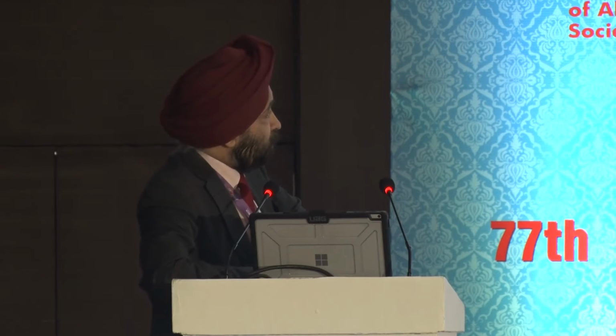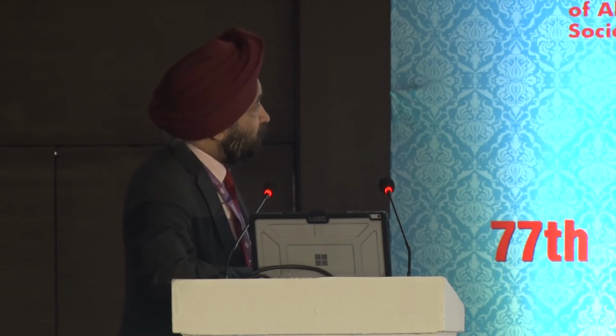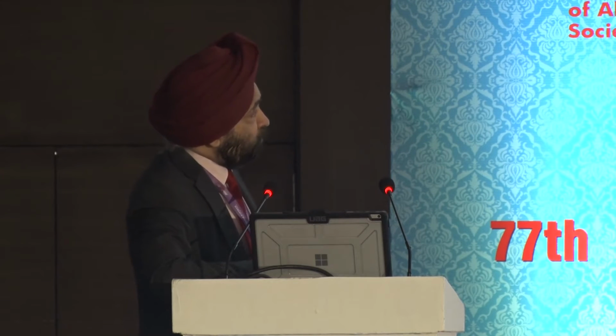Now what you see in this particular case is that we are taking out the nucleus and the posterior capsular rent appears. Now, what do you do in such a situation, which was the specific situation given to me? There is a hemisection of the nucleus, and because we have not done a great hydrodissection, because it was a polar cataract, it is difficult for us to bring down the hemisection. So I have injected viscoelastic, I have made another opening there, and the sandwich technique is being used, where I am using two hands to actually levitate out the nucleus.